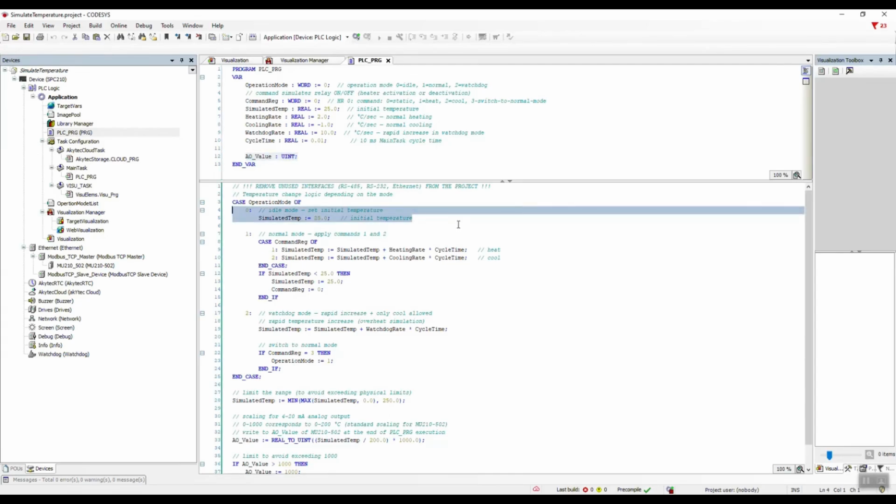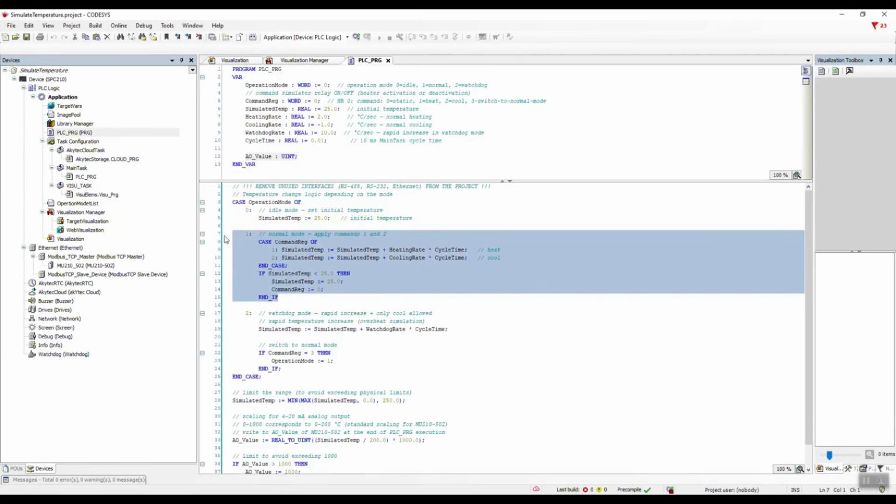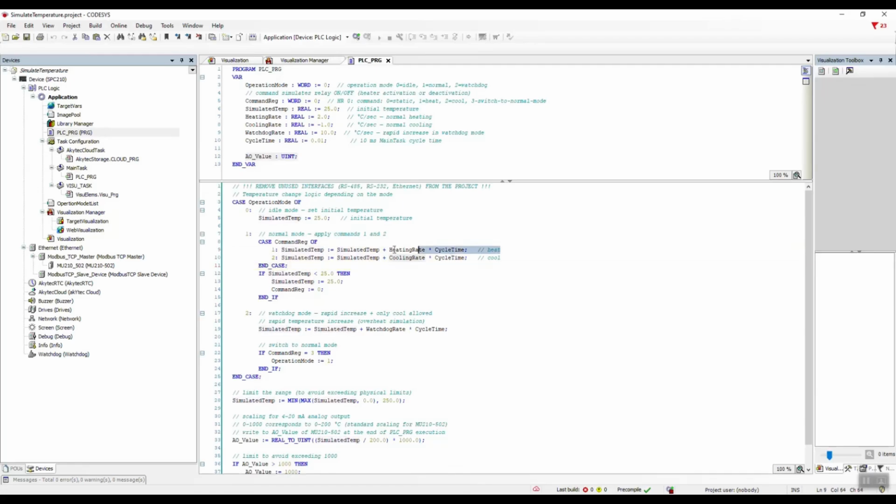The first condition of the case operator. If the emulator is in the initial mode, we set the simulated temperature to a value corresponding to 25 degrees Celsius. The second condition of the case operator. If the emulator is in normal mode, we check the next condition. If the emulator command is set to simulate heating, then on each cycle of the main task, meaning every 10 milliseconds, we increase or simulate the temperature inside the sterilizer according to the specified heating rate.